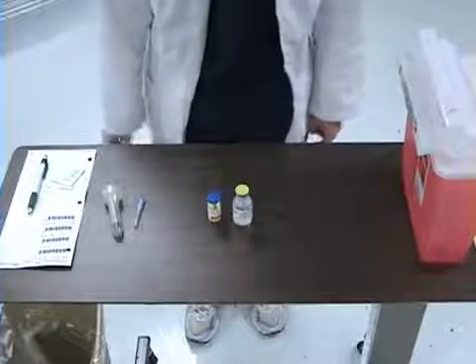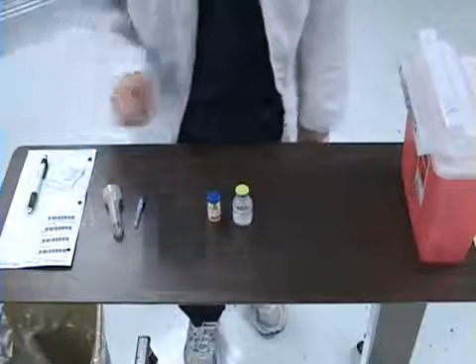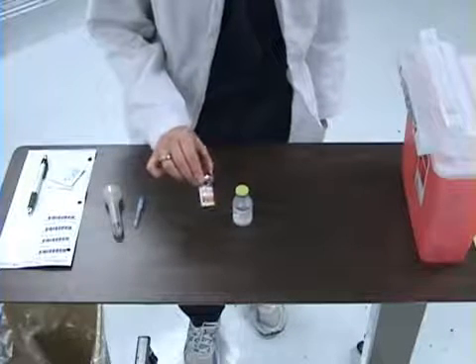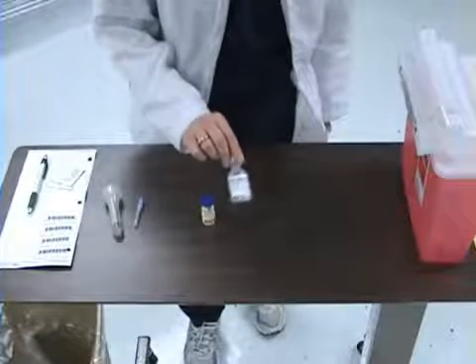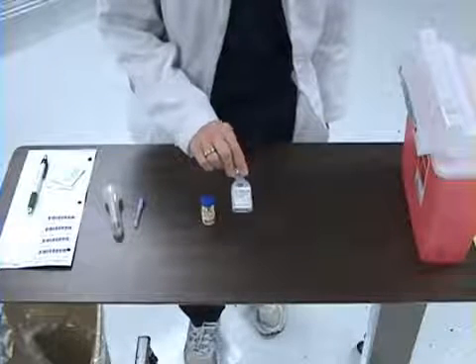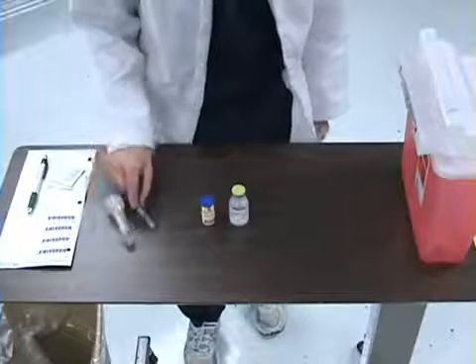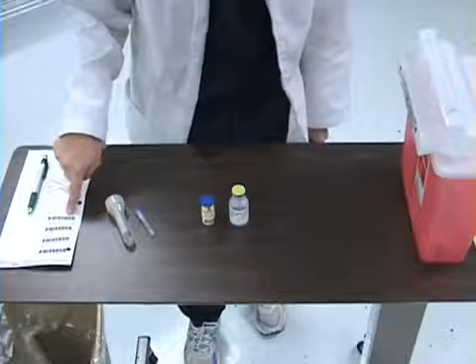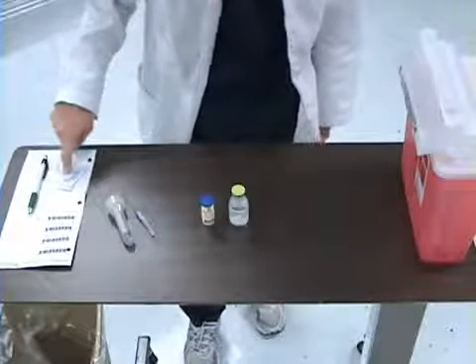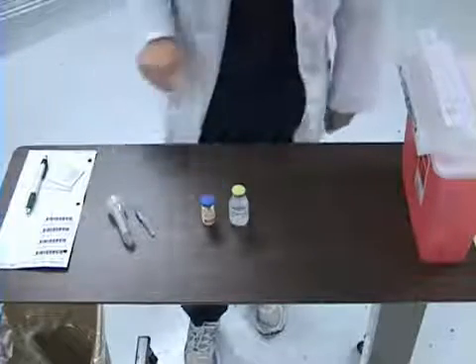I will begin by gathering my supplies. For this procedure, I need the medication that is ordered, a diluent — in this case normal saline — a syringe, needle, patient labels, alcohol preps, a sharps container, and a trash container.